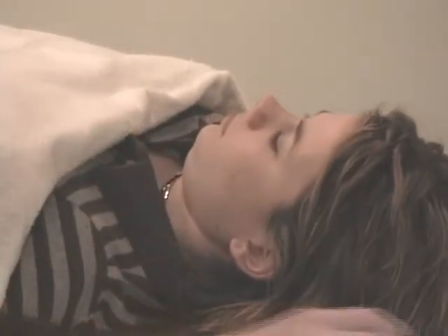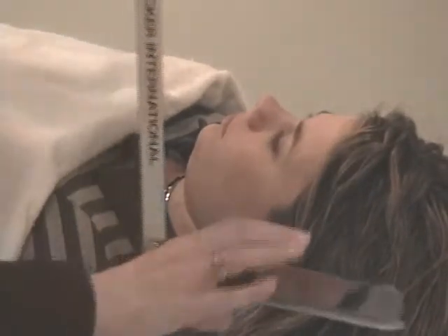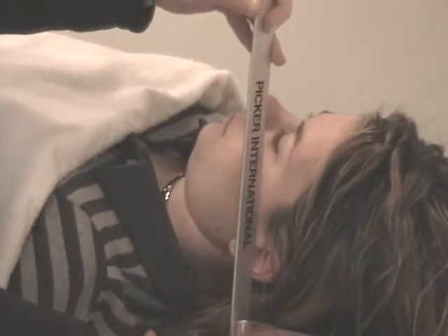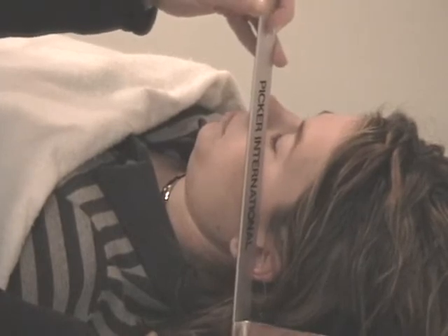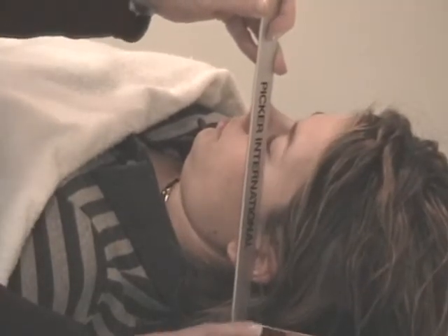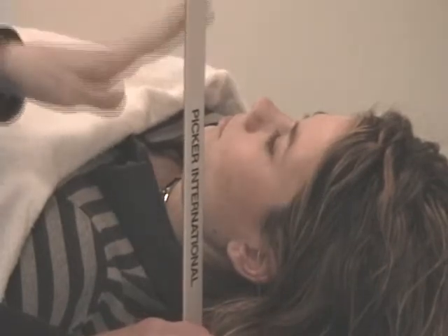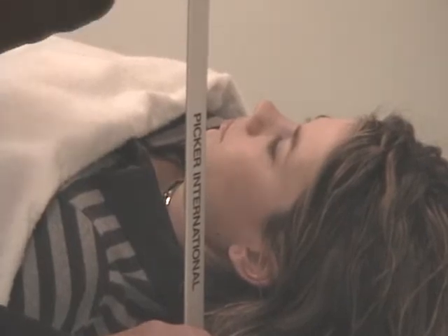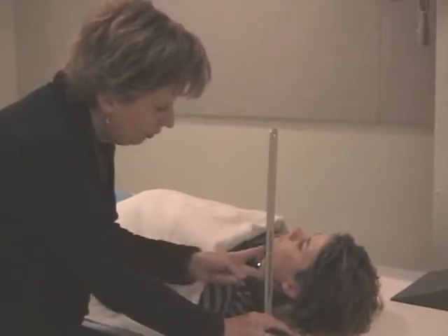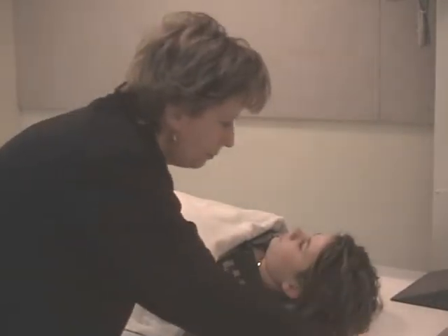We're going to end up having her tuck her chin, and I'll use these calipers. Now, with an injured person, you're going to want to be careful. A pen might be more convenient here, but something with a straight edge, when you're first starting, you can use this device to help you decide just how far that head needs to be tucked. Just a little, okay, we're happy now. But if somebody's injured and you hit this table, the noise can be excruciating. So just be careful if you do happen to choose calipers. Some straight edge when you're first beginning is a great idea in order to help you visualize that orbital meatal line to be perpendicular.